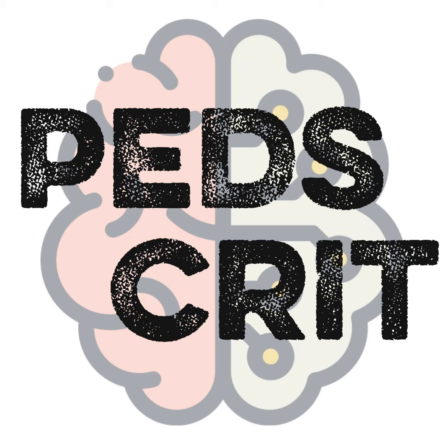For example, even in the case scenario you just used, myocarditis, it is a viral inflammation of the myocardium. So this comes as a bridge while you rest the heart so that the heart can recover. That's very simplistically said, but that is the primary goal. Sometimes the recovery doesn't happen, and then you are able to transition them to a transplant. So it's always a bridge to organ recovery or transplant.